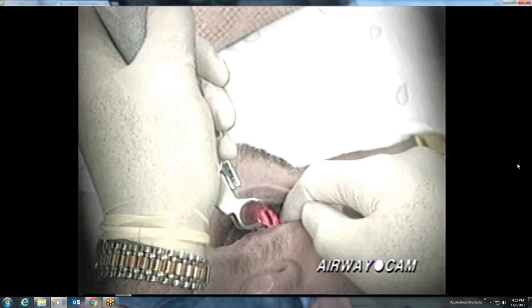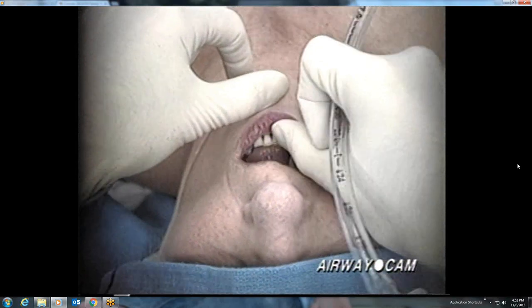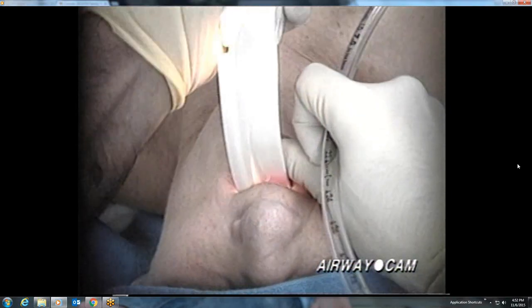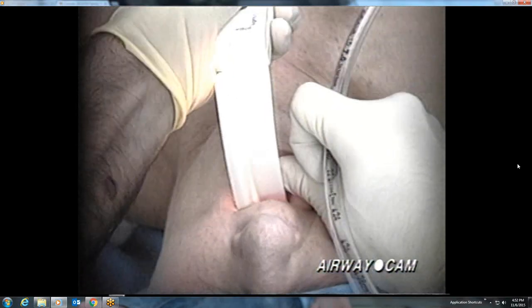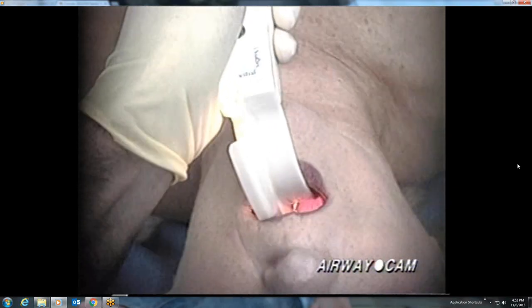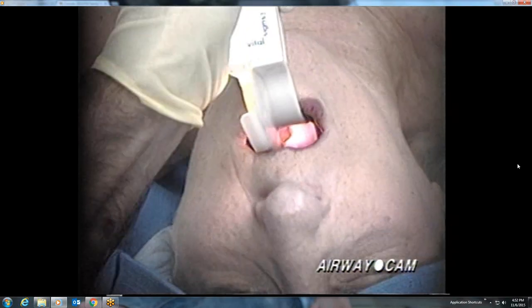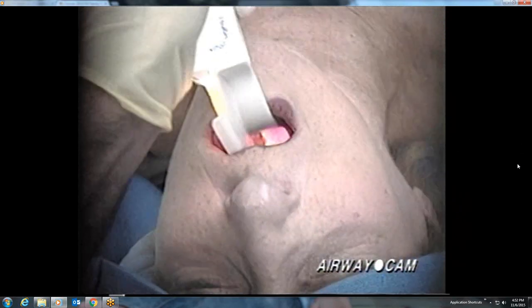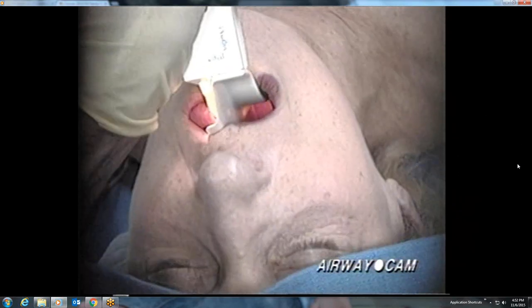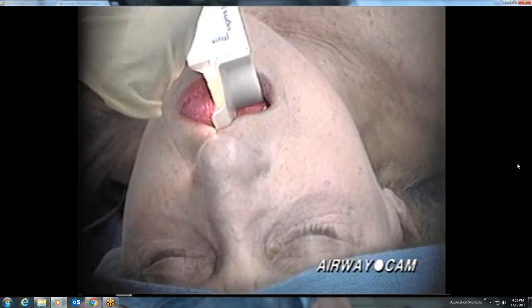This next intubation is done with a Macintosh No. 3 blade with a fiber-optic light source on an elderly woman with no upper teeth. When it comes to direct laryngoscopy, no teeth almost always means no problem. The posterior pharynx is well seen and the blade is further advanced.